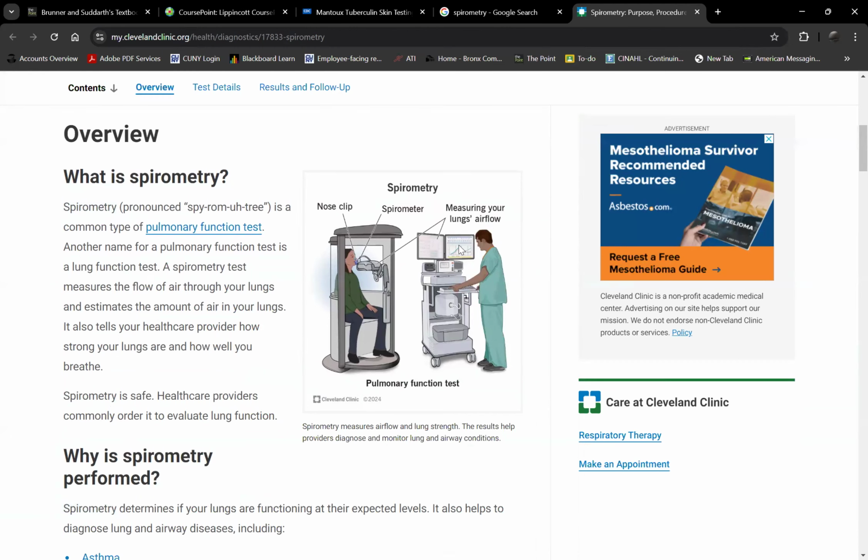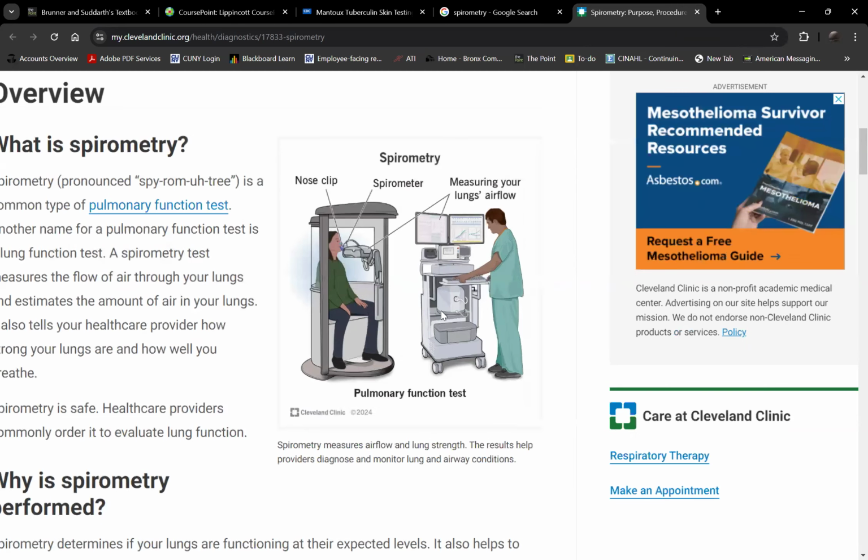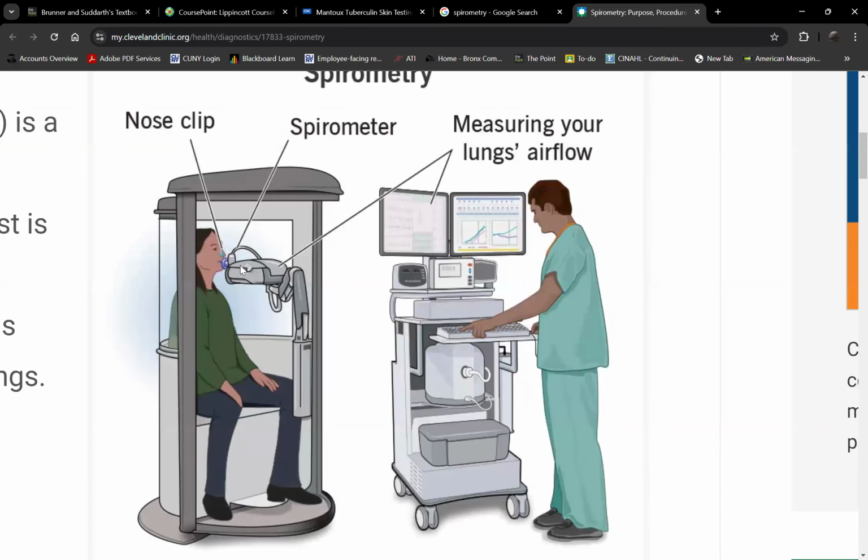So this is the reading now. So the patient's doctor will, so this is only in the clinic. You won't see this in the hospital unless the clinic is in the hospital. Okay, so this is it. So that's how it looks. Patient will be asked to do a few maneuvers, so the doctor will instruct them, okay, exhale normally, put it in your mouthpiece, and then blow, okay? So they'll blow into the mouthpiece, and it will record a few readings.